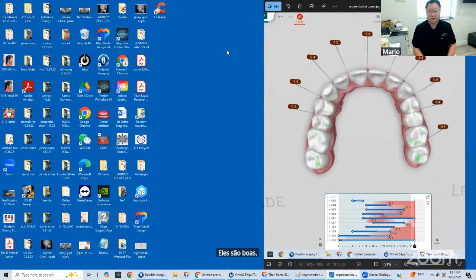So everything you mentioned, I think it's not new, but it's going to be realized soon with really advancement in technology, right? I mean, we have cone beam CT, but cone beam CT is also evolving.